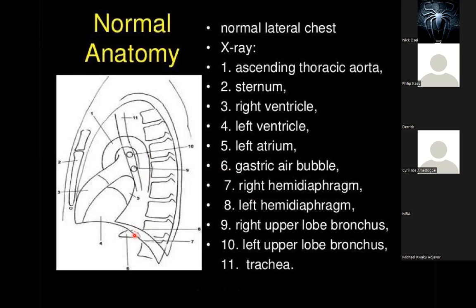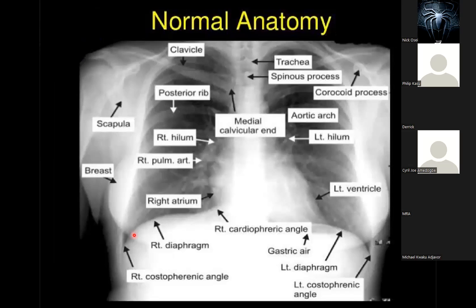The gastric bubble is the extra piece of air, or the collection of air, in the stomach. Now, mind you, the gastric bubble is just the air fluid level that is seen in the stomach. I hope that is clear. What do I mean by air fluid level? You know water will definitely settle down and air will come up. So the sharp demarcation or sharp contrast between the relative locations seen on X-ray is what we refer to as air fluid level. All right. So this is the gastric bubble. This is the air fluid level. This is the fluid level.